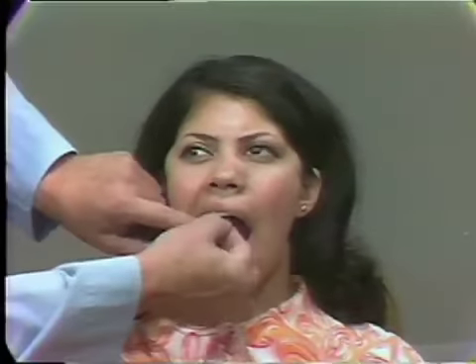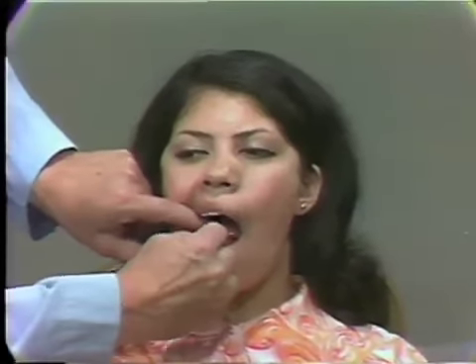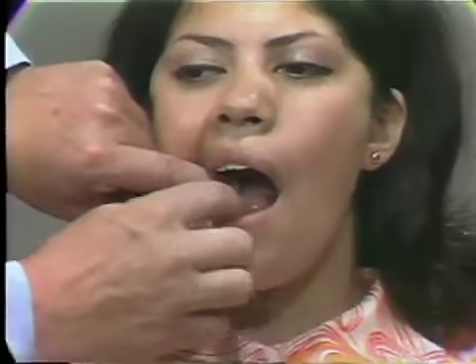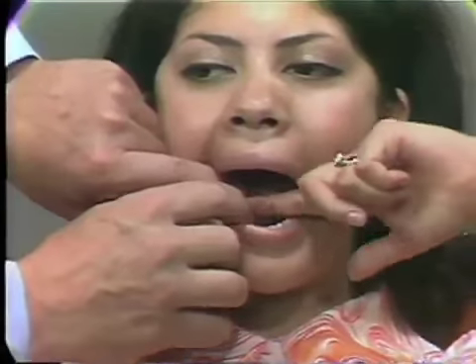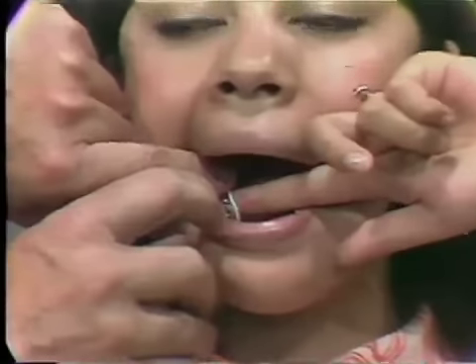The mandibular arch is surveyed in the same manner as the maxillary arch, except in the mandibular third molar region, a finger can be used to hold the film in the patient's mouth. The packet is placed in the mouth, positioned vertically, and then the lower edge is swung underneath the person's tongue, and then once again positioned vertically. And now take your left index finger, your elbow up, and hold the film packet against the teeth.